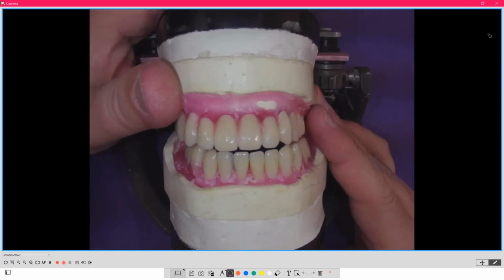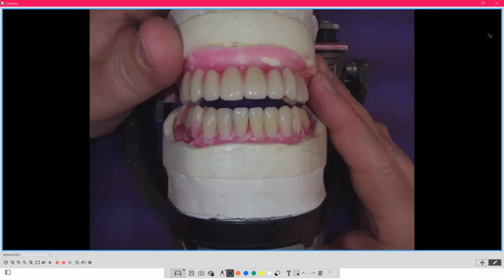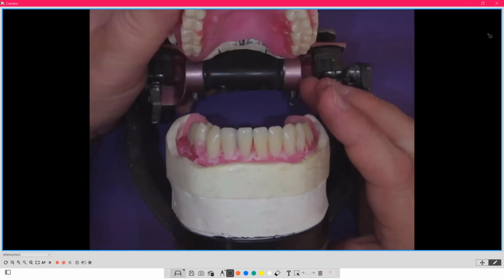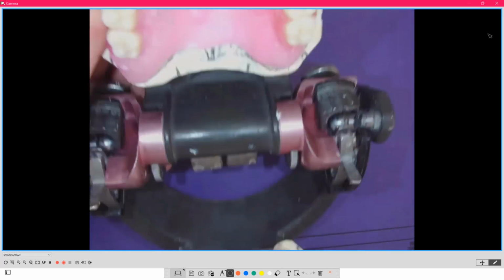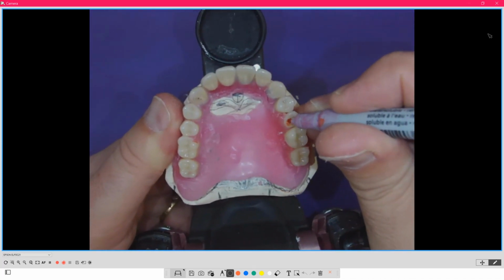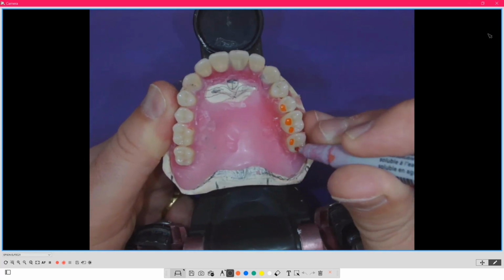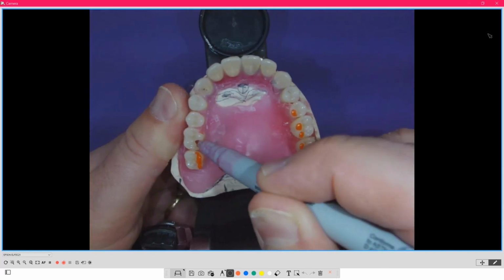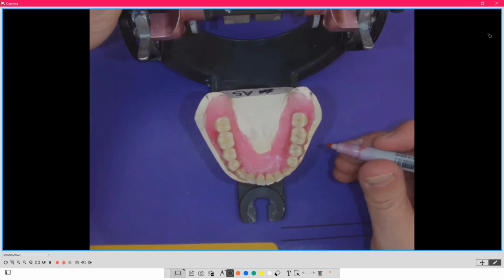I want to now mimic a chew cycle. Is that chew cycle more vertical or is it more horizontal? Then I'm able to check the teeth. So let's do that. Quickly, these are the cusps that come into contact with the fossa and its counterpart. I circled them in red. These are the cutters. These are the mincers, from the mortar and pestle. And on lingualized occlusion, it's this one down here.